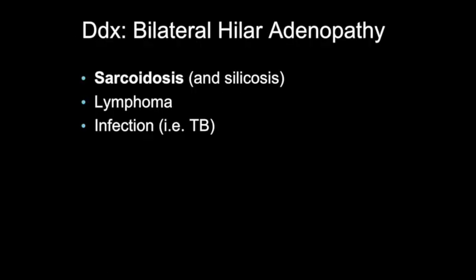So we have bilateral hilar and mediastinal adenopathy. The purpose of this video is to train your eye. The primary differential is sarcoidosis and silicosis, lymphoma, and infectious abnormalities — specifically tuberculosis. This is a case of sarcoidosis.